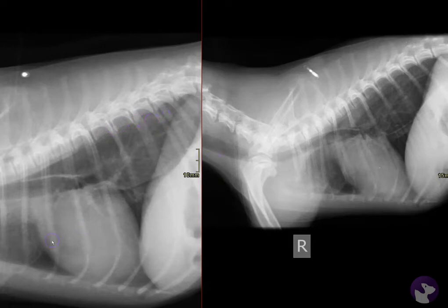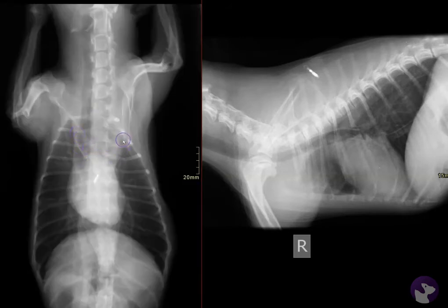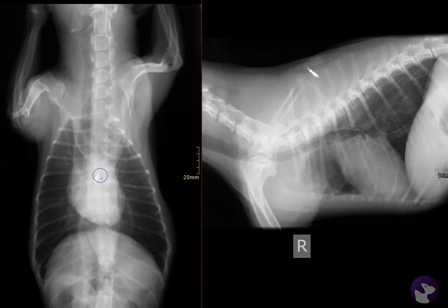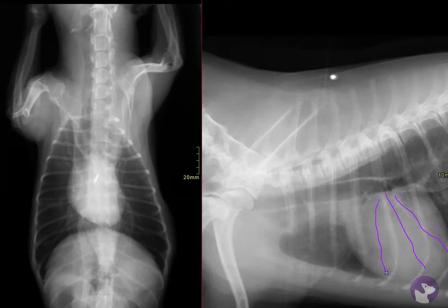The other thing we really need to look for is evidence of aspiration pneumonia. In this case, we've got a little bit of increased opacity within the cranioventral thorax. However, this patient's limbs are superimposed with that region. We don't really see any evidence of that in our opposite lateral projection, and in our ventrodorsal projection we're not really seeing any evidence of that cranially. So I think this is probably due to superimposition. The most common place we might find an alveolar pattern is in our right middle lung lobe, which is at the level of the cardiac silhouette in our lateral projection — the bronchus comes down here, so we oftentimes find an alveolar pattern somewhere in this region.